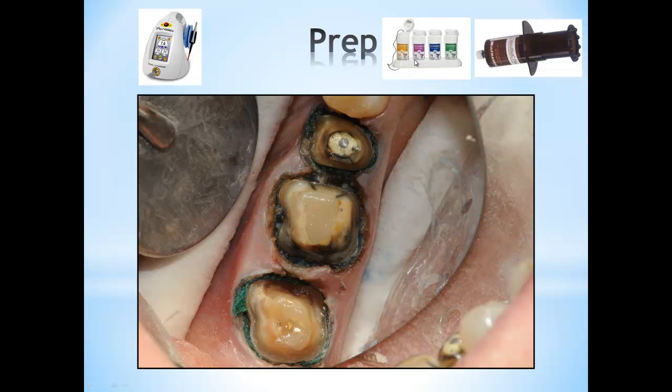You use different sizes of the cord material, so make sure you don't end up with big recessions. In this case, I pack the cord all around it, and it stays around the cervical part. I've also been using ViscoStat hemostatic agent all around to make sure that I have tissue control, there's no seepage.